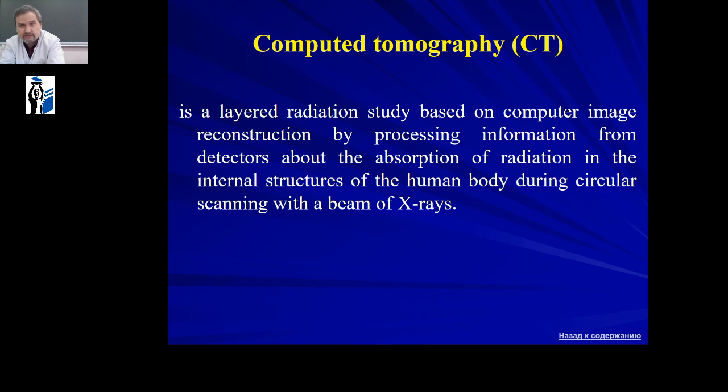Computer tomography, or CT, is a layered radiation study based on computer image reconstruction by processing information from detectors about the absorption of radiation in the internal structures of the human body during circular scanning with a beam of X-rays.